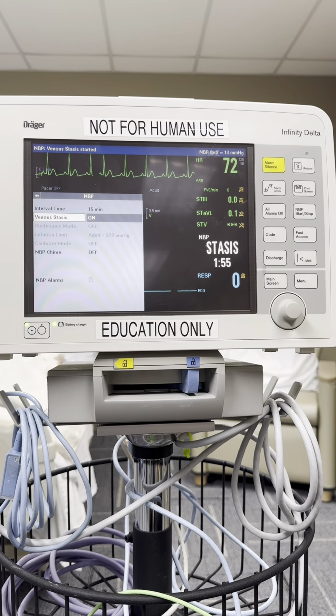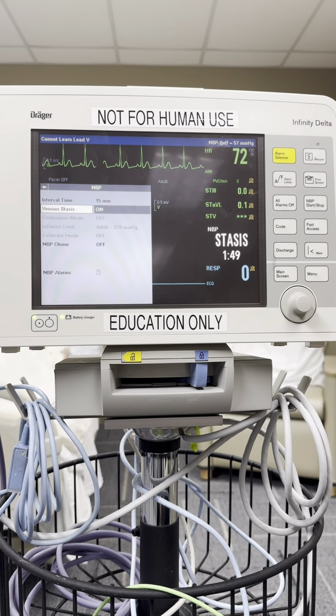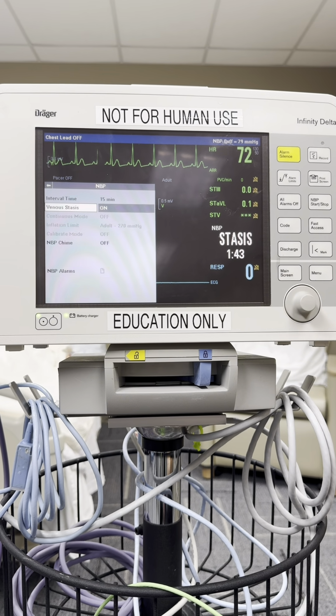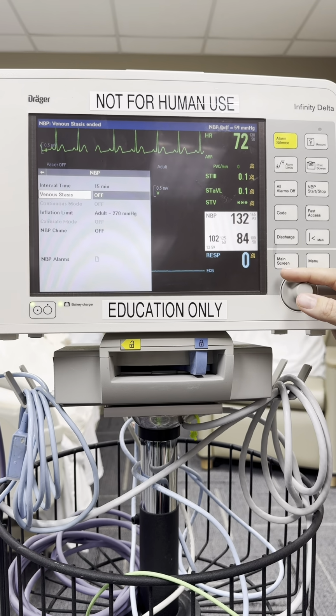It doesn't blow it up completely to occlude the blood flow, but it does help with getting those veins nice and bouncy. It will automatically turn off after 2 minutes, which is helpful. You don't have to worry about forgetting the tourniquet on or anything like that. I personally like it better than a tourniquet, so it's a nice little feature.